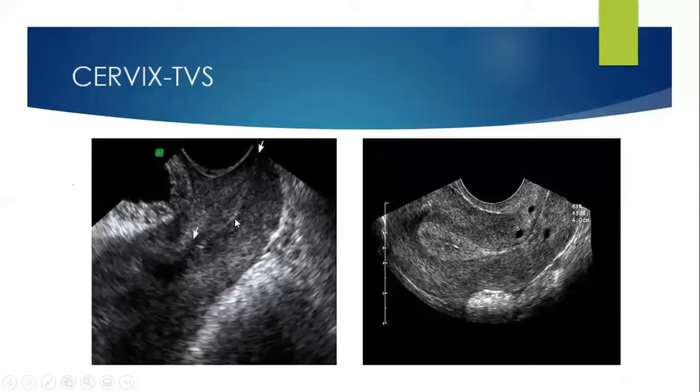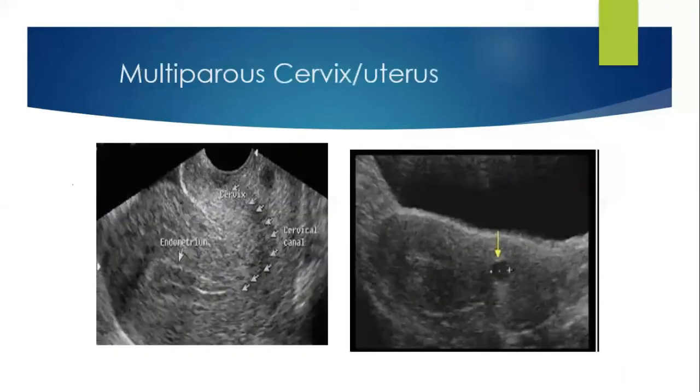So whenever you are asked to look for the cervix in a transvaginal scan, withdraw your probe, or if you're lucky enough, sometimes you are able to identify the Nabothian follicles. If you see these Nabothian follicles, then this is the area of the cervix. There is no particular importance of measuring the length of the cervix. The importance is the echogenicity and the presence of any abnormality or pathology, any sac, or, let's say, incomplete abortion. That is the reason we must know how to identify the cervix.